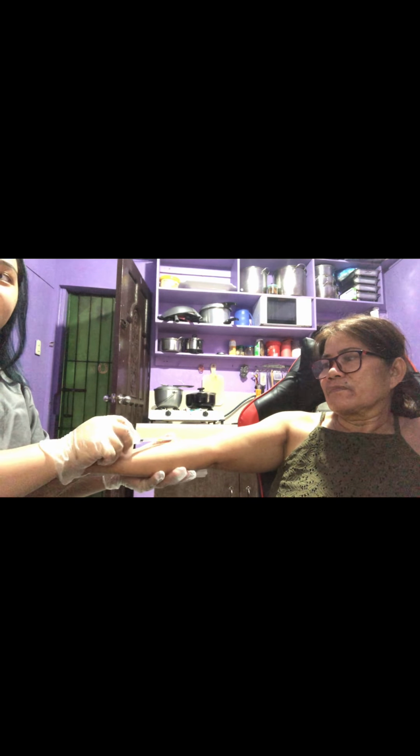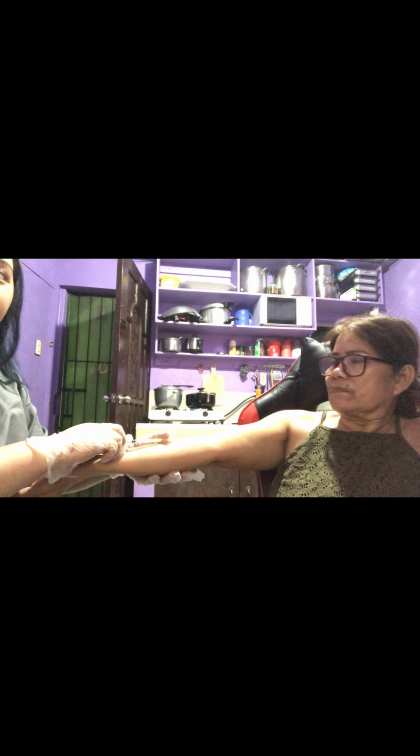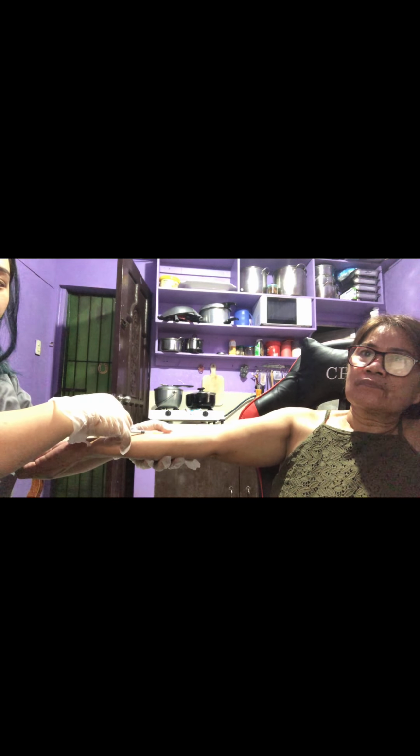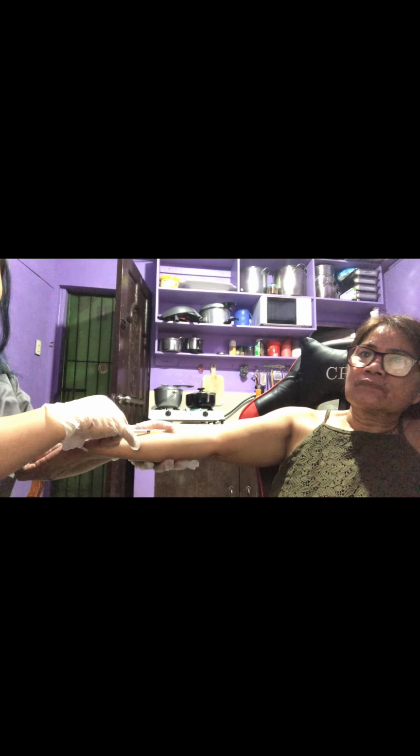Next, place the syringe almost flat on the patient's skin and thrust the needle at a 10 to 15 degree angle level. Once the bevel cannot be seen, anchor the syringe and introduce a small amount of solution until a small wheal is formed. Quickly remove the needle and wipe the excess fluid from the skin of the patient. Do not press the wheal.